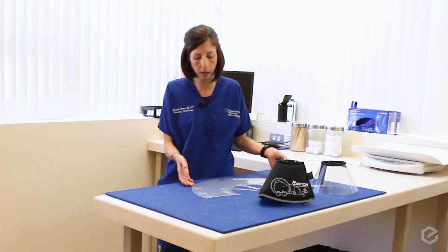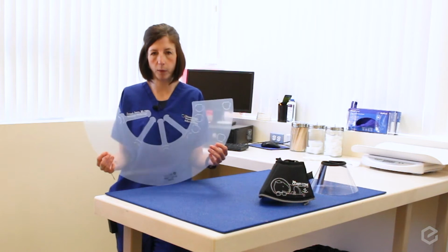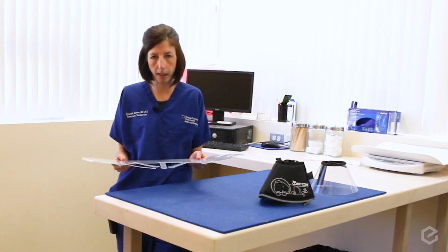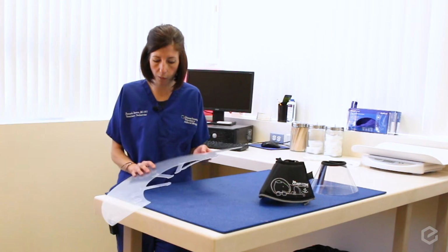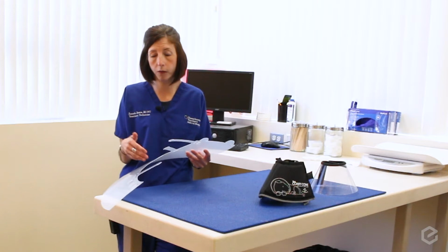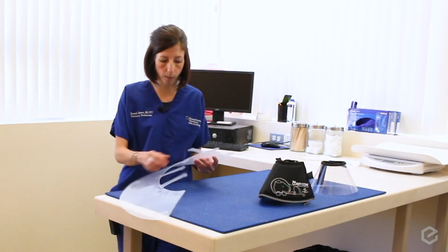The one that you're typically going to get and see is this plastic e-collar that we put together and fit appropriately to your pet before going home. So we'll show you how to put it on and put it together in case you ever have to do that. The first step that I typically do is create your hole for your collar or some gauze to go through to keep it attached to your pet.